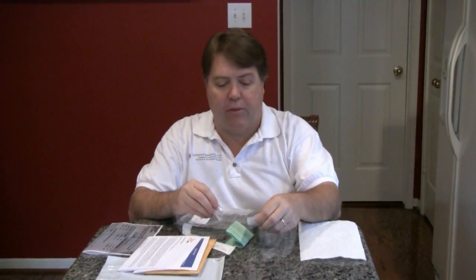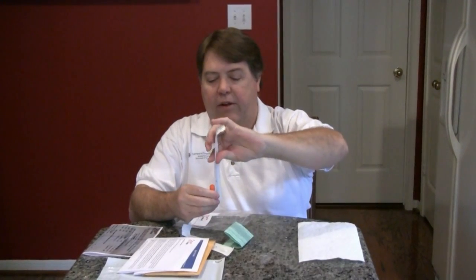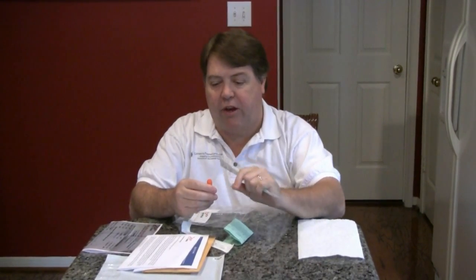So the summary of this is that we're going to take this, scrape it in our cheek, open the vial, push the end of it into the vial, and then break it off — so that way the end that touched our cheek goes into the preservative without us touching it with our finger. Then we're going to screw the cap back on. That's the gist of this procedure.